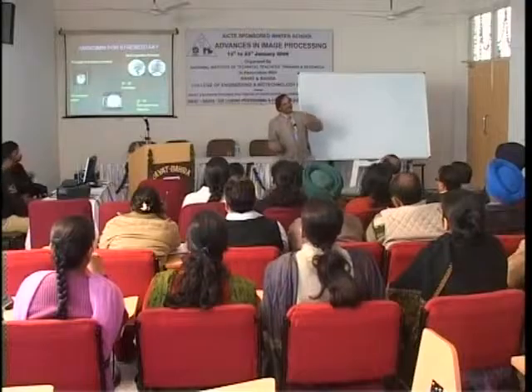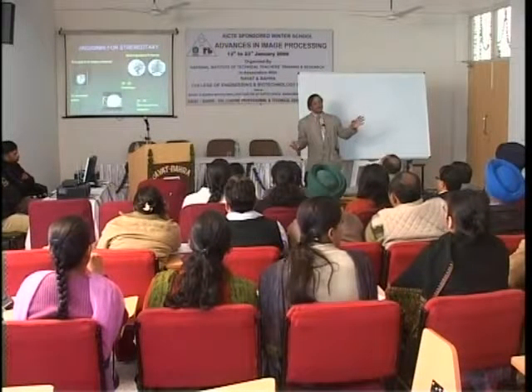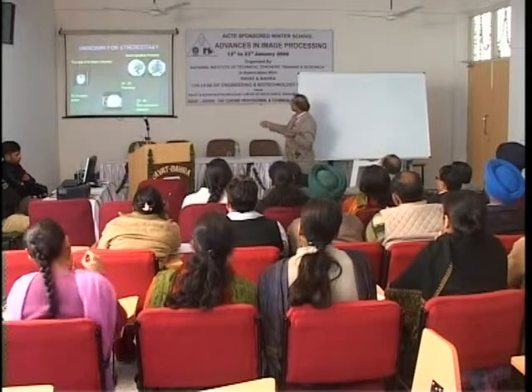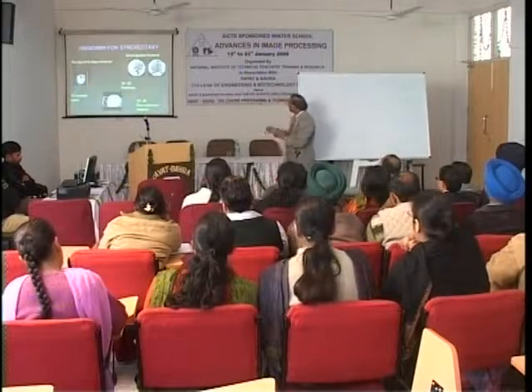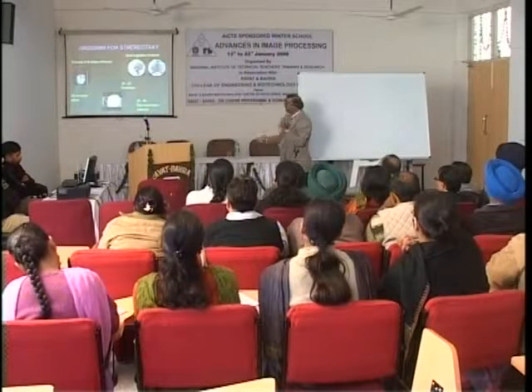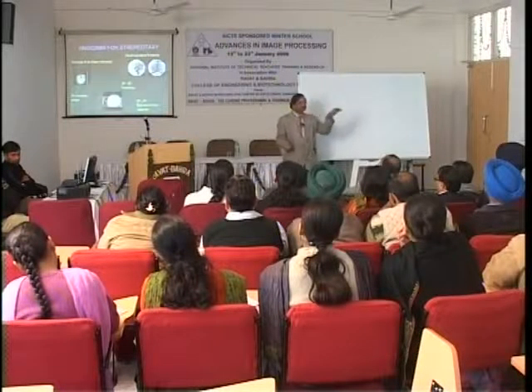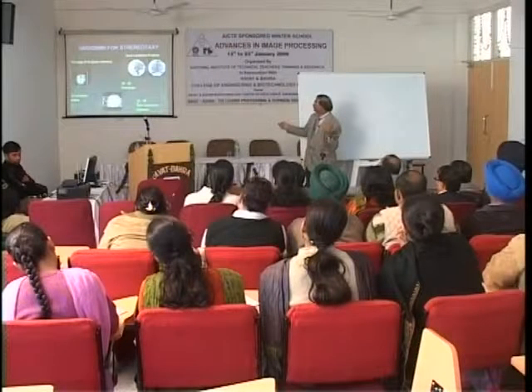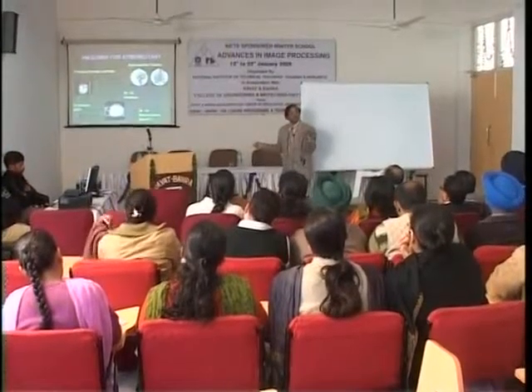Here is another set of things, PET CT. Here we are doing an angiogram, that means studying the blood vessels, and we are trying to correlate it with an MR, or fusing this on an MR, to find out where that particular abnormality is in space in relation to the MR. So you can do fusion of this kind of angiogram, or fusion also for stereotactic surgery.